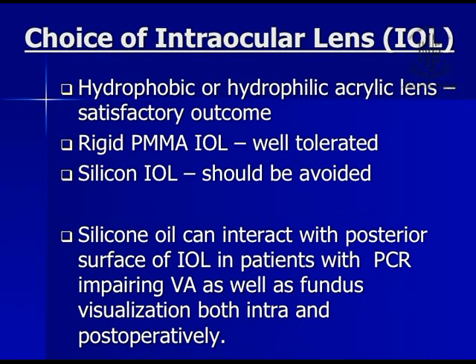Coming to the choice of intraocular lens, hydrophobic or hydrophilic acrylic lenses, they give satisfactory outcome. A rigid PMMA IOL is also well tolerated, but do avoid using silicone IOL. The reason being, silicone oil tends to interact with the posterior surface of IOL in patients with PCR. So thereby impairing the visual acuity of the patient, and also fundus visualization both intra as well as postoperatively becomes difficult.